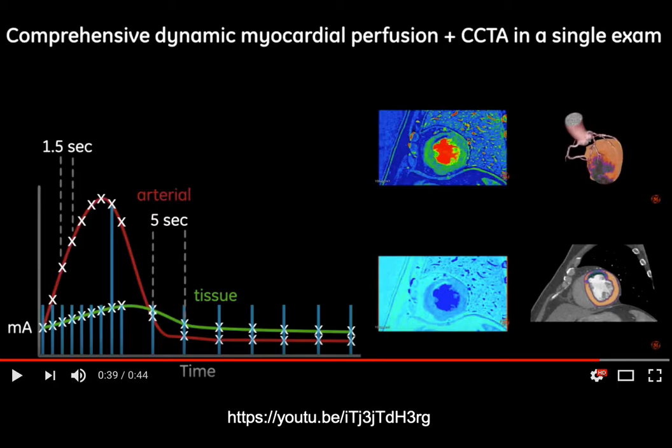Your perfusion is not a tiny 1 millimeter vessel that is open or closed. It's happening over large territories. So this picture doesn't need the highest spatial resolution, because it's going to be a spatially coherent territory that will be hypoperfused if a vessel is obstructed. So you can change the scan parameters a bit to overcome the fact that you have to take many more pictures.